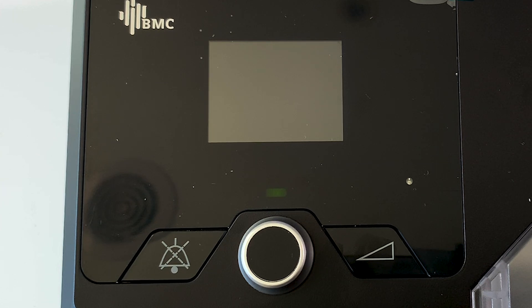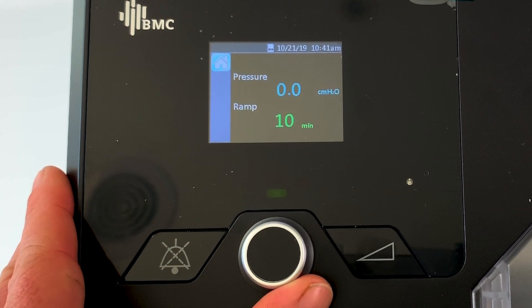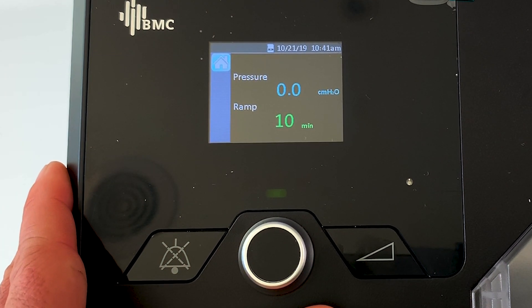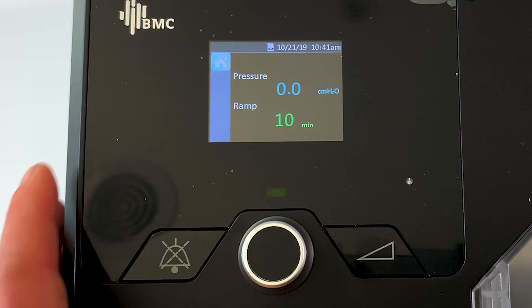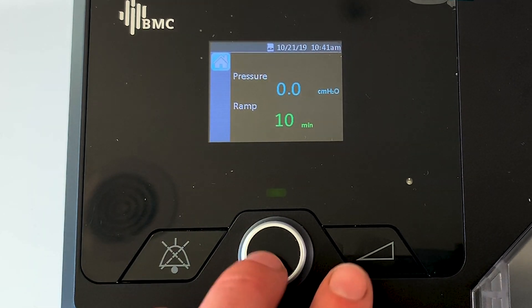Clinical settings are a little bit more in-depth. This is where you can change things like the mode of the machine, or things relating to the pressure of the machine. It's a little bit more advanced, but for some of you it might be very handy - it enables you to make the therapy a bit more tailored to your specific needs.